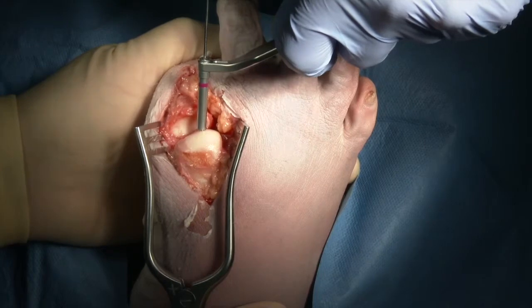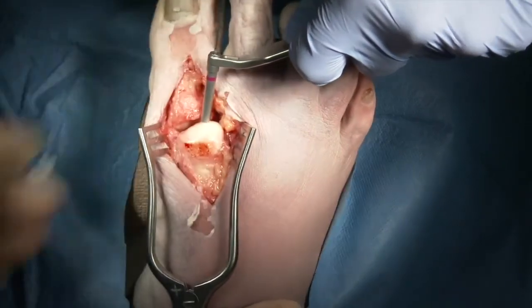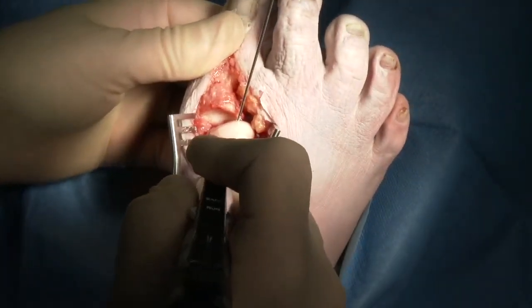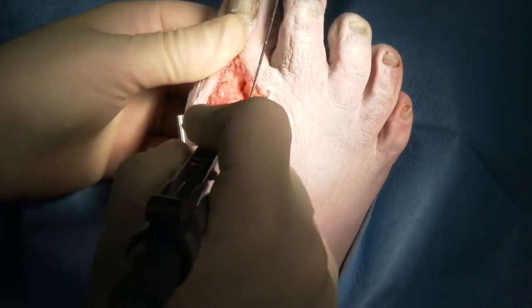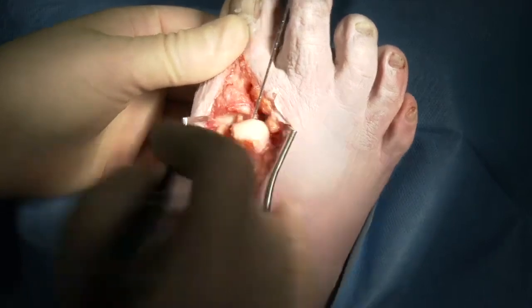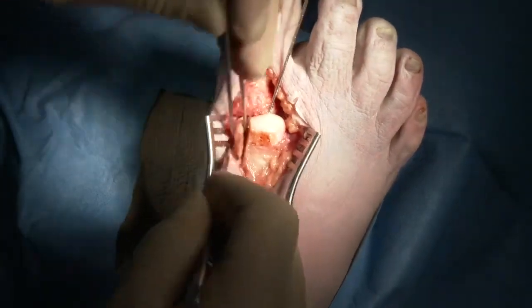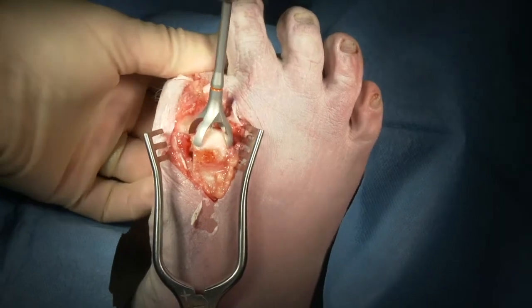Once the joint surfaces are exposed, we'll take a guide wire from our reamer, place it in the metatarsal head, and drive this centrally up the long axis of the metatarsal. We can then demarcate where the sagittal sulcus is and remove the medial eminence using a sagittal saw. This makes it easier to get the reaming to be completely symmetric with the shaft of the metatarsal.